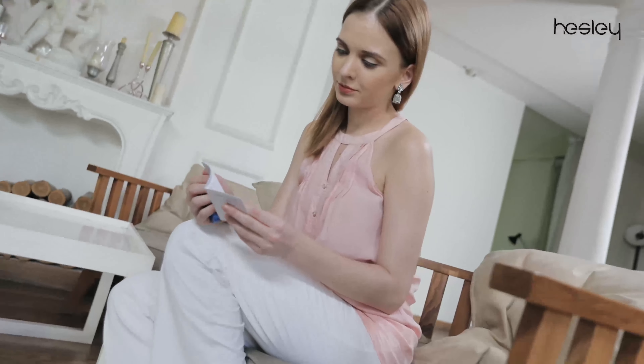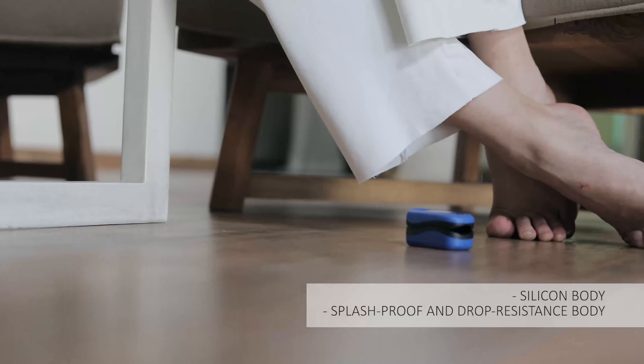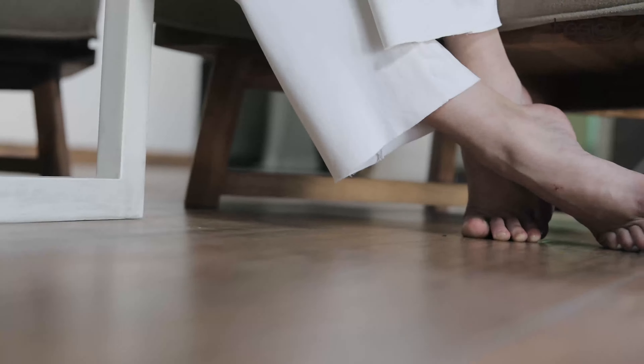With a unique and impressive design, this oximeter is not just splash proof and drop resistant, but also comes with a silicone body, which gives you a better grip.